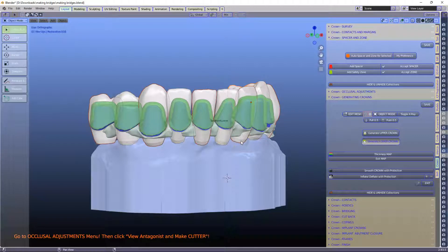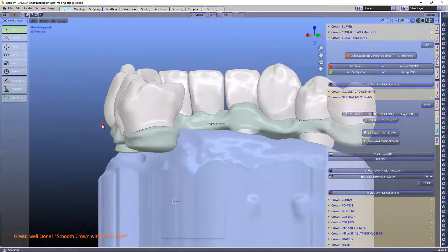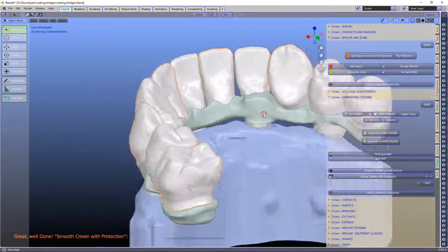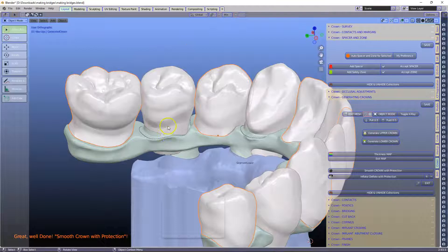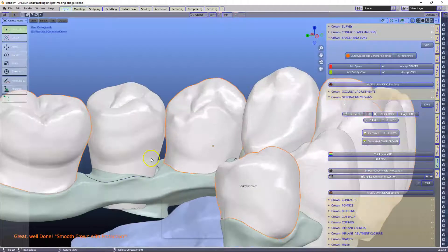Now let's remesh and generate these and see what happens. This takes a while because there's just so much going on. Okay, so that took a while, but it's actually done the job — which is really surprising. It's joined them up and generated crowns all in one go.